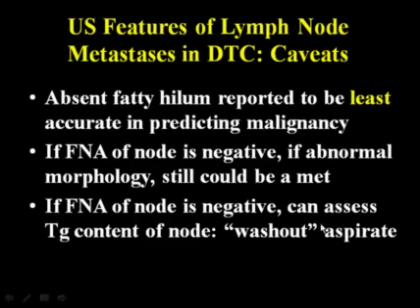If FNA of the node is negative, you can assess the thyroglobulin content of the node. So you can rinse the needle tip in saline, put it in the refrigerator, and either send it right away or wait and see if the cytology is negative.